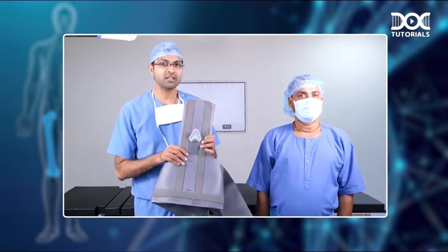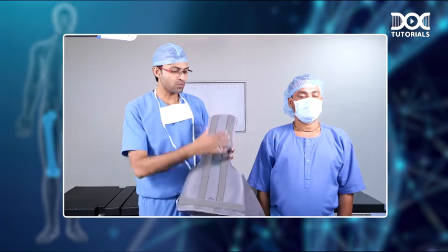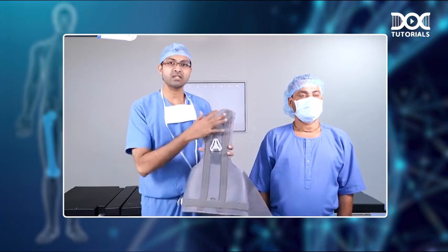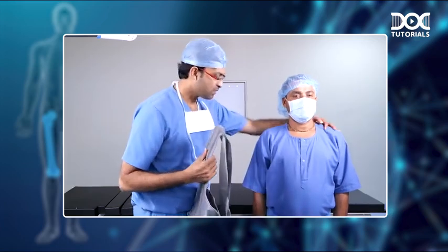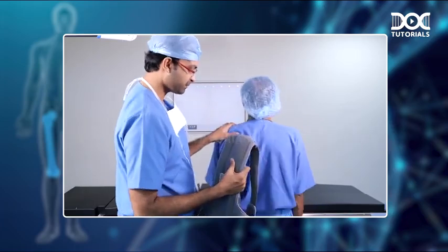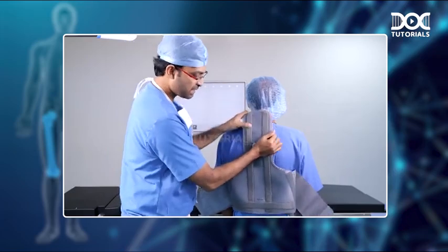So how do you put the Taylor's brace? You can see that it is a very long brace and there are two large metal rods at the posterior aspect which give adequate support to the entire spinal column. So how do you put this? You ask the patient to turn around like this. You stand on the back of the patient and you place this part posteriorly like this.